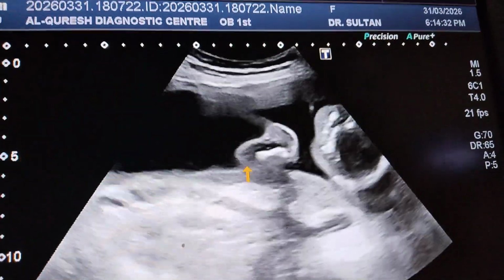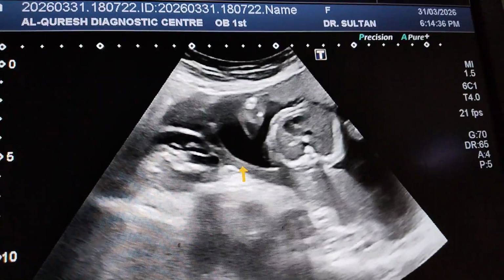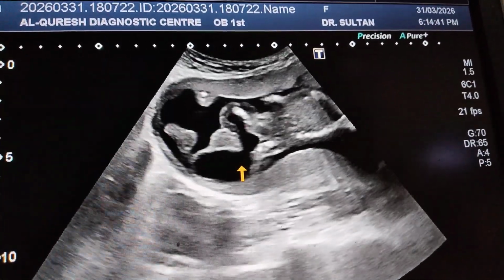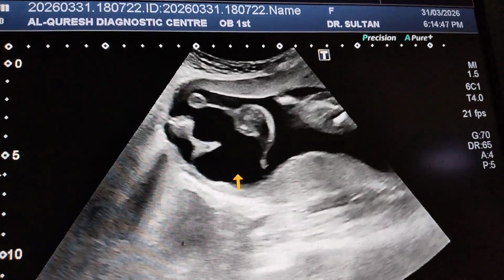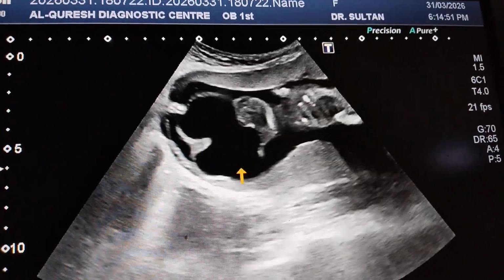So this lesion, in my opinion, is, look here, sacrococcygeal teratoma. There are four types of sacrococcygeal teratoma according to the location.